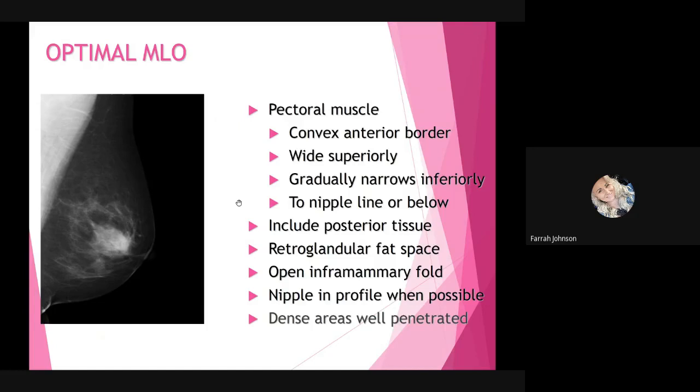You should also be able to see retroglandular fat space. You should see an open IMF, meaning that you'll see this nice little border down here at the distal end of the breast. You should be able to see the nipple in profile when possible. And then you want to see dense areas of the breast tissue well penetrated.